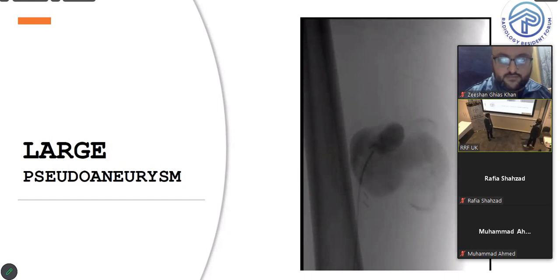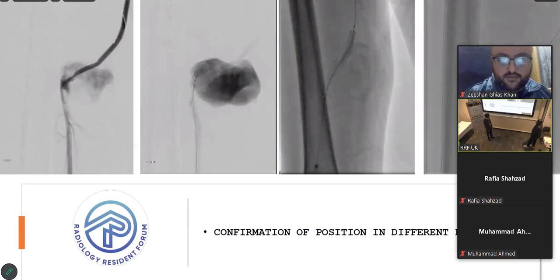If you go to the next images here, this was the initial image, and the second one we can see on the screen is when the dye was actually injected. We can just about see a faint outline of the obturator graft. Then a catheter was put in place to allow the opening of this arterial wall that was previously damaged. And then when the dye was last put in, we can see that there's now a new connection that was formed.